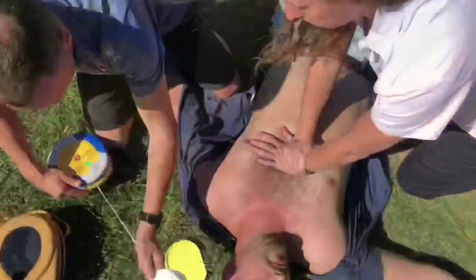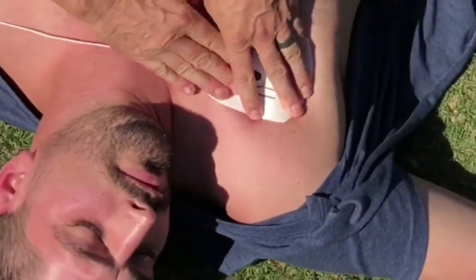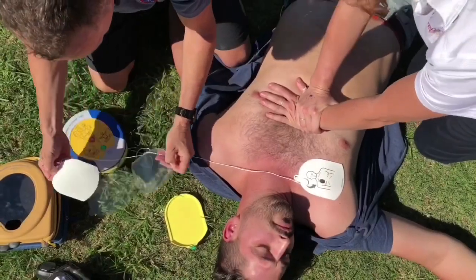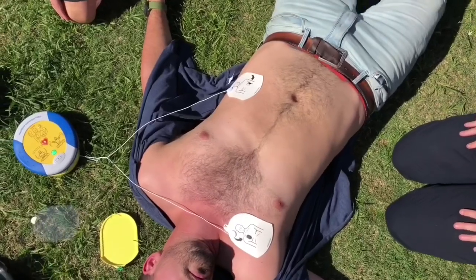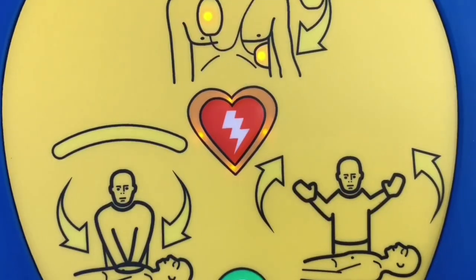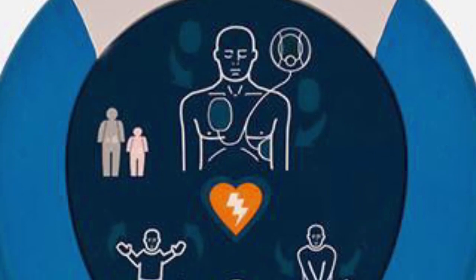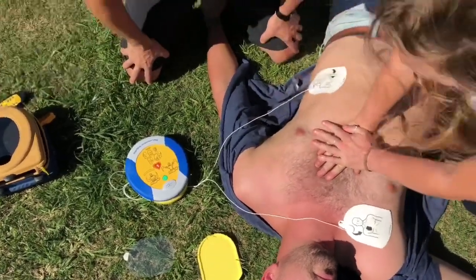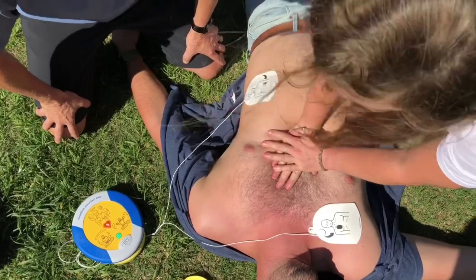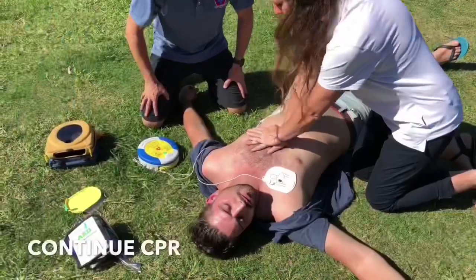Pull the green tab to remove pads. Peel pads from liner. Remove any excess hair from the patient where the pads are placed using a surgical razor that's also in the prep kit. The device will then assess heart rhythm — do not touch the patient. The HeartSign 350p defibrillator has clear voice prompts to help you with your CPR, instructing you to place overlapping hands in the middle of the chest and press directly down in time with the metronome, which helps you maintain the correct rate and speed.